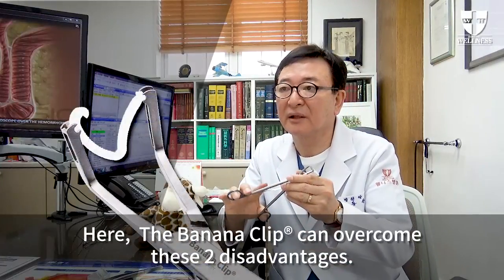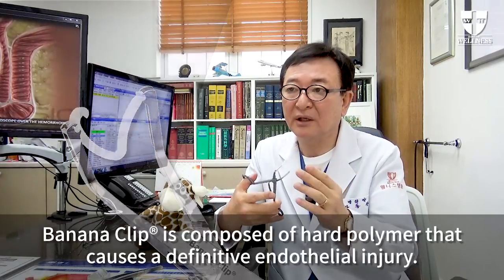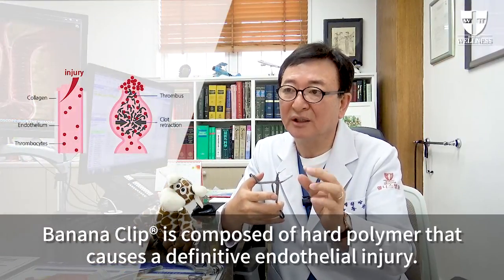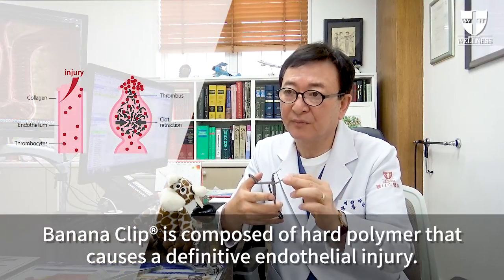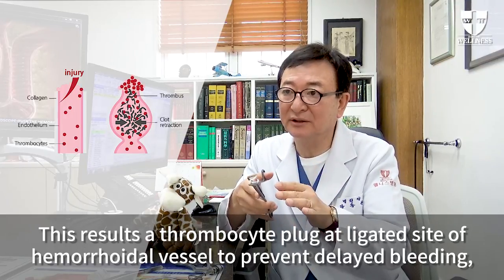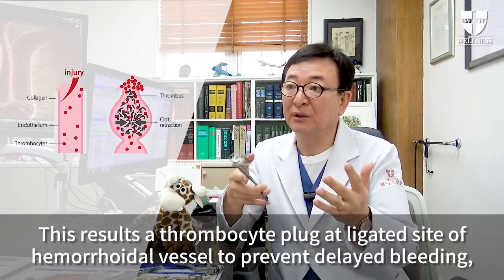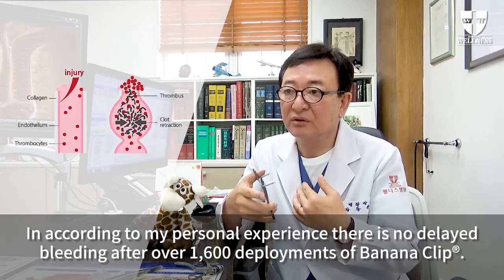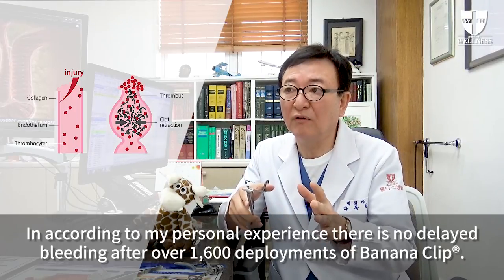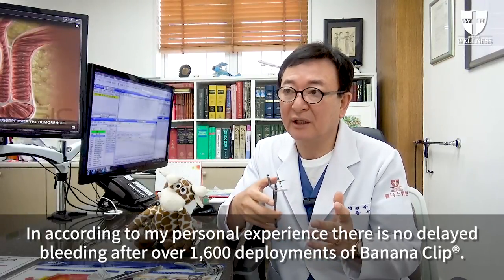The banana clip can overcome these two disadvantages. Banana clip is composed of hard polymer that causes a definitive endothelial injury. This results in a thrombocyte plug at the ligated site of hemorrhoidal vessel to prevent delayed bleeding. According to my personal experience, there is no delayed bleeding after over 1,600 deployments of banana clip.